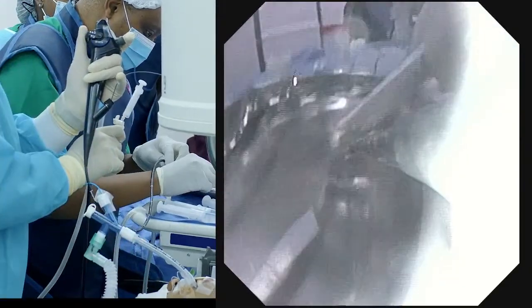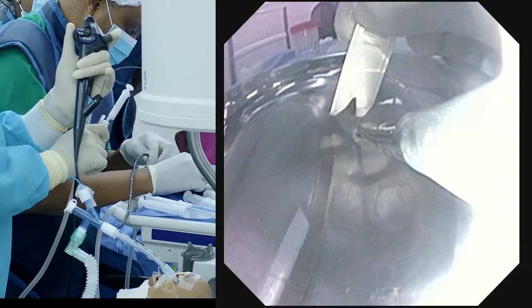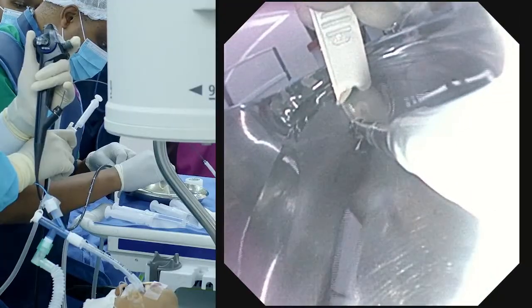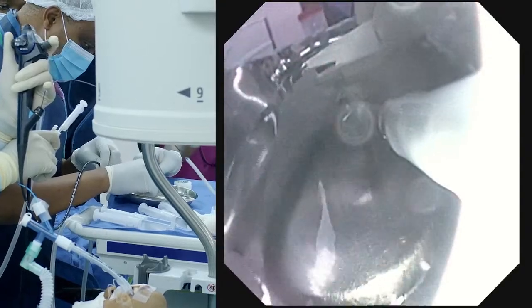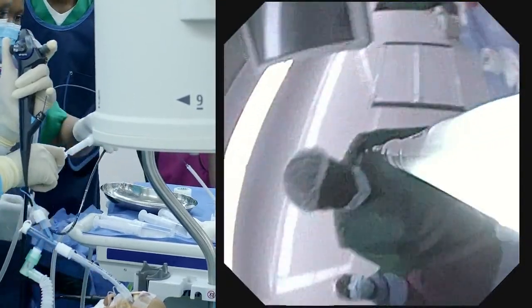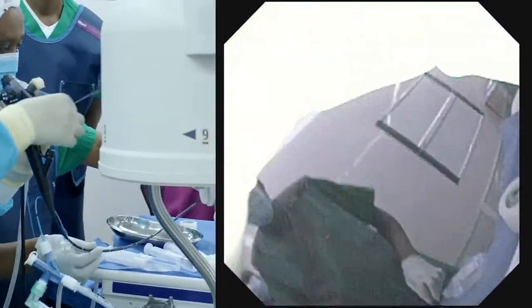And our balloon has already been inflated. About 6 seconds? That was 4. So we check first. Yes, that's a tissue sample. Put the balloon in there. So the cryoprobe can come out. You got the probe?